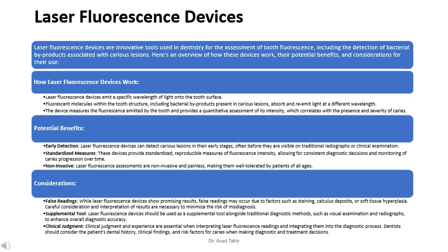Standardized measures. These devices provide standardized, reproducible measures of fluorescence intensity, allowing for consistent diagnostic decisions and monitoring of caries progression over time. Non-invasive. Laser fluorescence assessments are non-invasive and painless, making them well tolerated by patients of all ages.